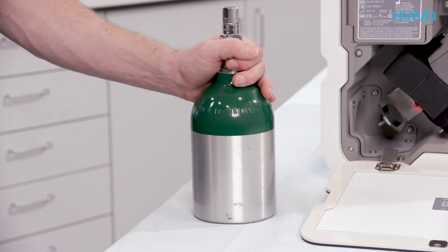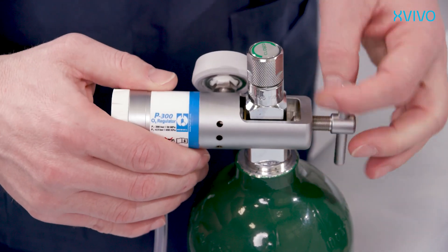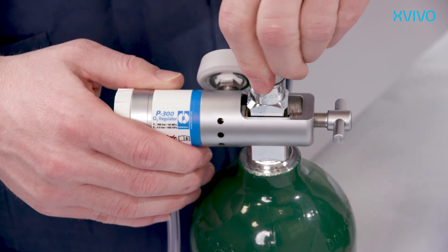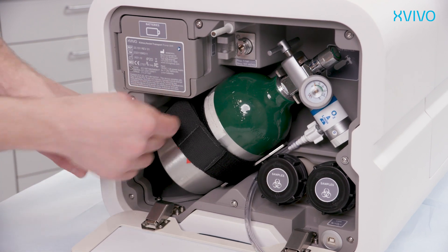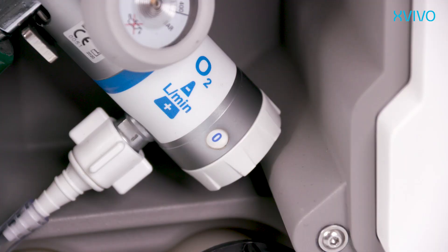To perform oxygenated perfusion, an oxygen source needs to be connected. Compatible oxygen bottles are specified in the instructions for use. Connect the oxygen cylinder to the supplied oxygen regulator and ensure a leak-free connection. Open the valve of the cylinder for a few seconds to check for any leakage. Once you confirm there is no leakage, securely strap the oxygen cylinder in its holder inside the compartment. Connect the oxygen tube to the connector. To prevent spillage of valuable oxygen, do not open the cylinder until the kidney is ready to be connected.